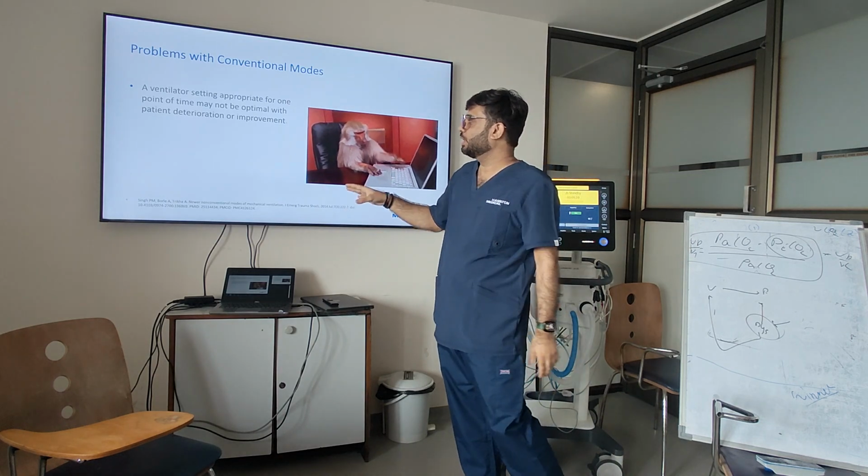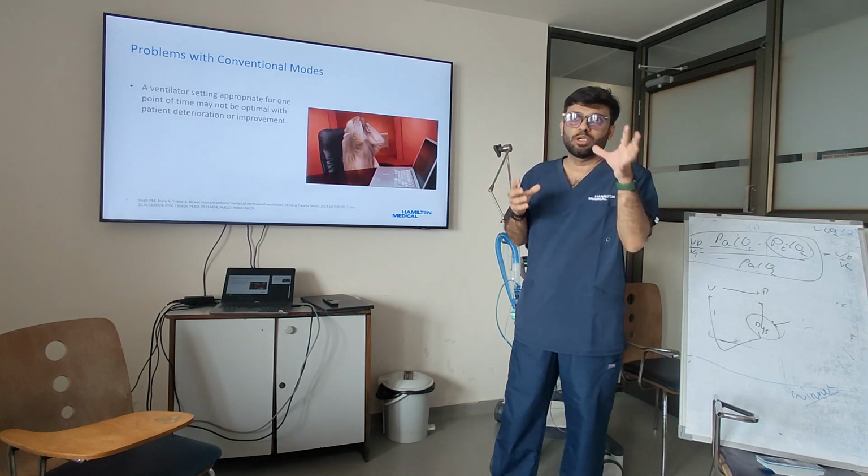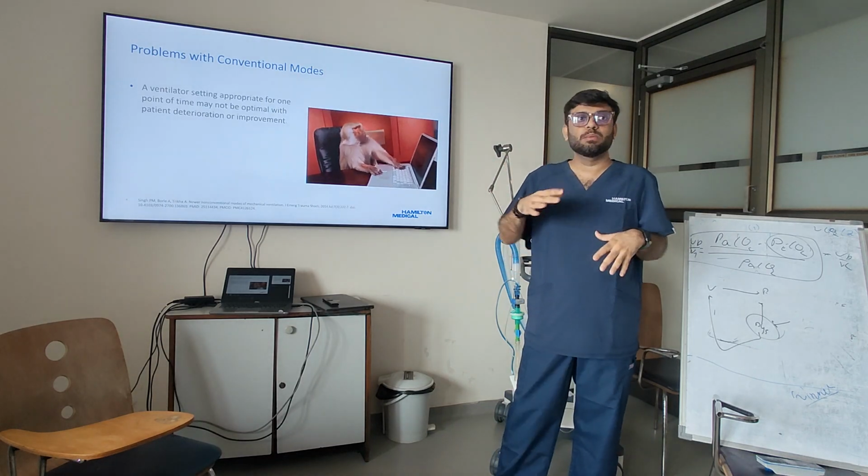So basically with all the conventional modes, when we do a ventilator setting appropriate for one particular point in time, it may not be optimal for all the time.